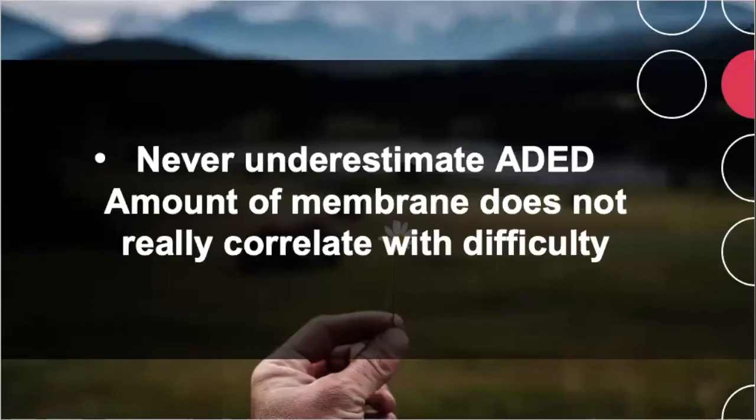Now, a very important message is never underestimate any type of diabetic vitrectomy case. Most of the time, the amount of membrane does not really correlate with the difficulty that we are going to have during surgery. With that, thank you.